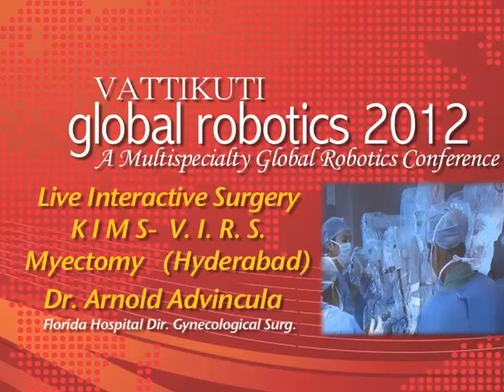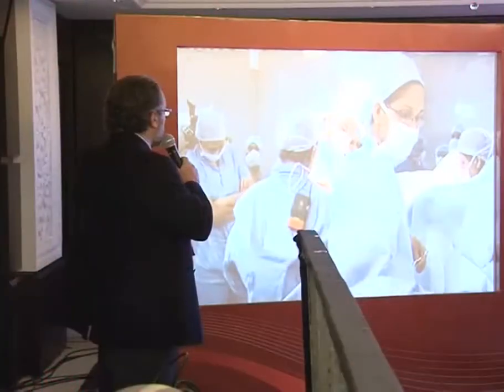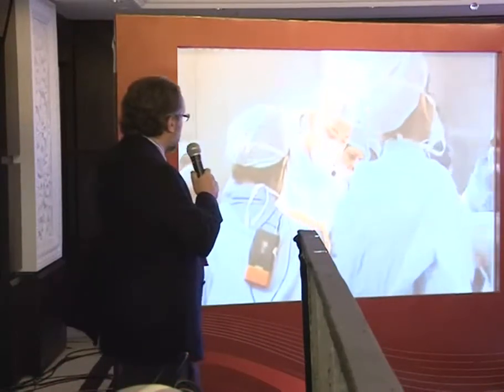We're starting a myomectomy here, correct? We are starting the myomectomy here. Excellent. And I'm just getting forced in. She's a very petite patient, so you can see here that I'm just beneath the falciform ligament to give myself some room.